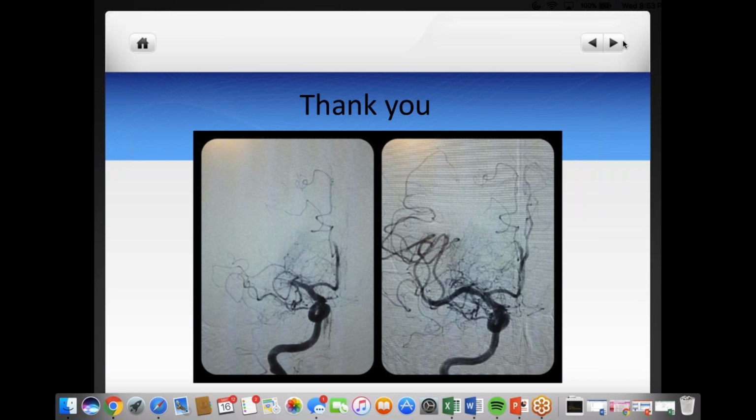That being said, some centers are doing CT perfusion on every single patient, and I don't think I would fault anyone for doing that. It's always good to have an extra amount of information.